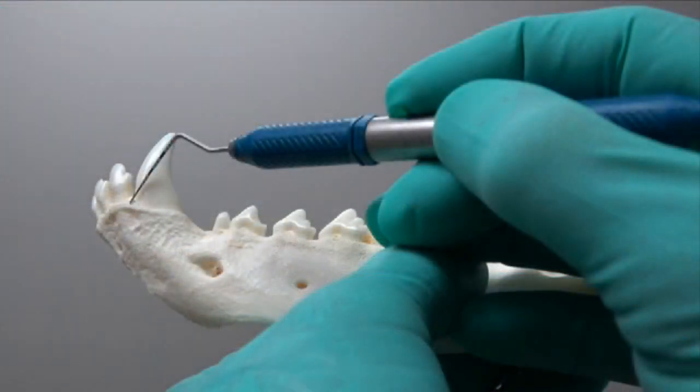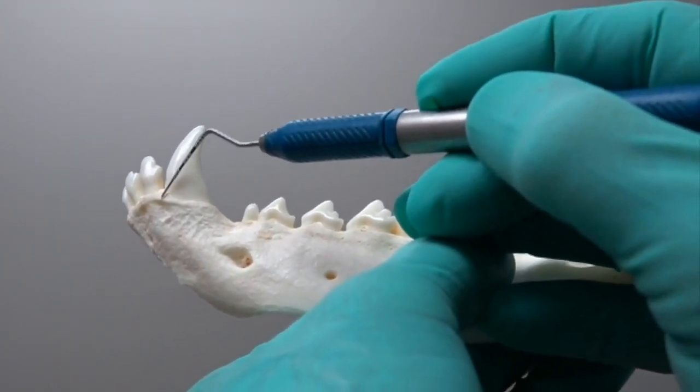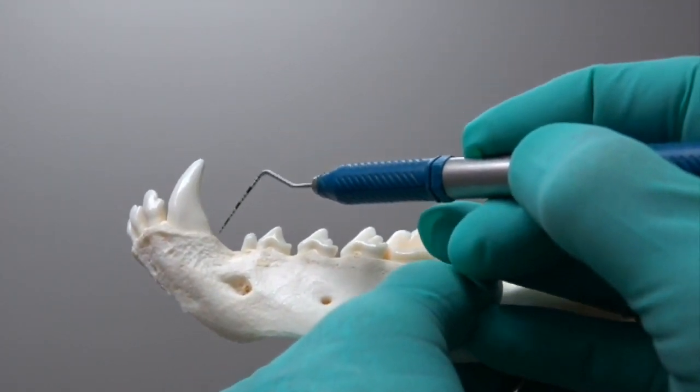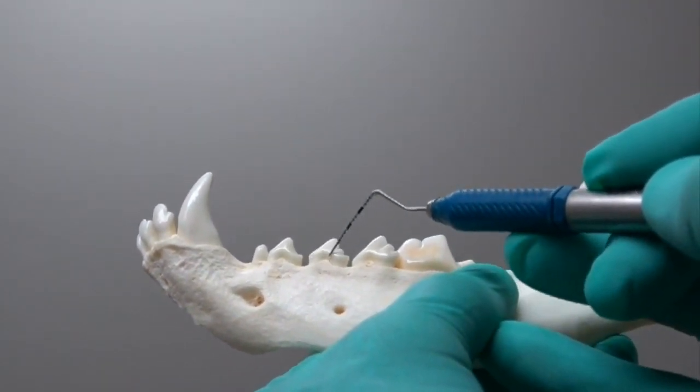For the mandibular canine, we start right next to that incisor and carry that back — little stab incisions all the way back at a 15-degree angle with the scalpel, stopping again at that third premolar.